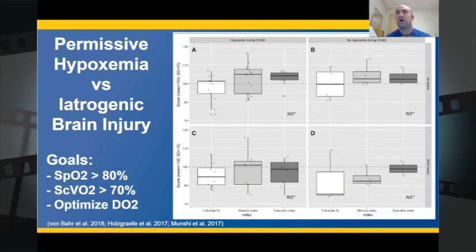The lower recirculation with the 3 cannula or double lumen VV approach results in higher saturations of 85 to 92%. This is ample oxyhemoglobin saturation for normal systemic oxygen delivery, as long as the cardiac output and hemoglobin concentration are adequate to maintain delivery of oxygen 3 times the oxygen consumption. However, ICU staff may be uncomfortable with arterial saturations under 90%, and education regarding oxygen delivery is important. Avoid temptation to turn up the ventilator settings or FiO2 above the rest settings during VV support. That's their direct quote, and there is some data to suggest that that is safe.